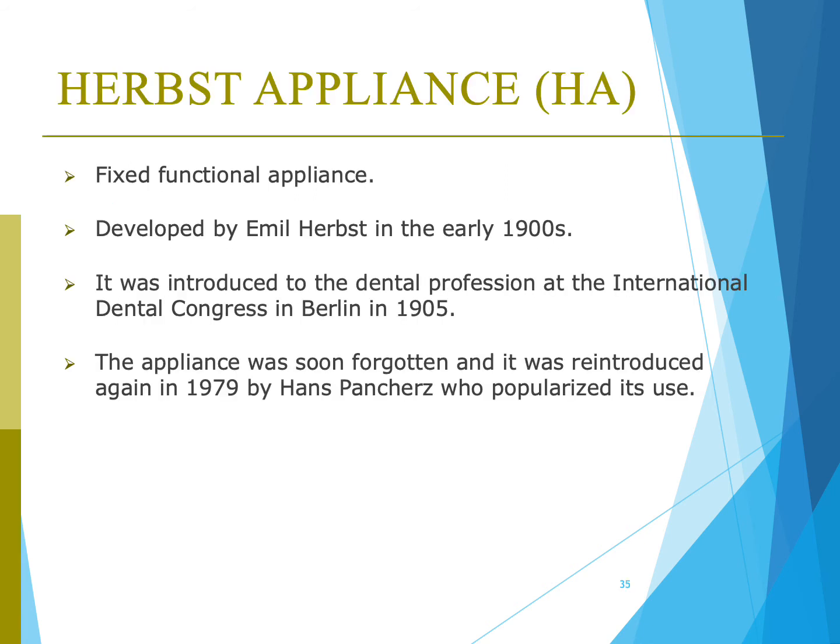Another type of myofunctional appliance is the Herbst appliance. Herbst is a fixed functional appliance that was developed by Emil Herbst in the early 1900s. It was introduced to the dental profession at the International Dental Congress in Berlin in 1905. This appliance was soon forgotten and was reintroduced in 1979 by Hans Pancherz, who popularized its use.